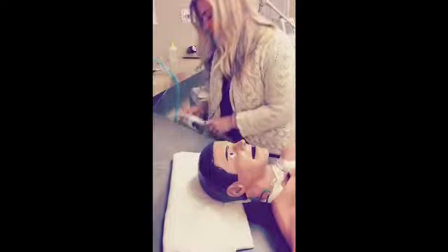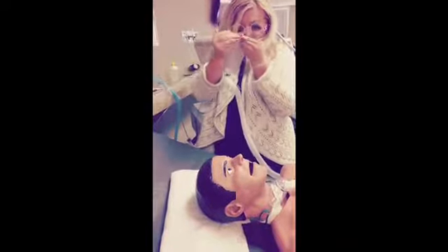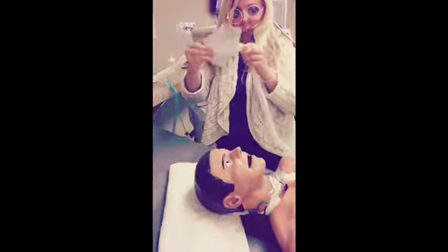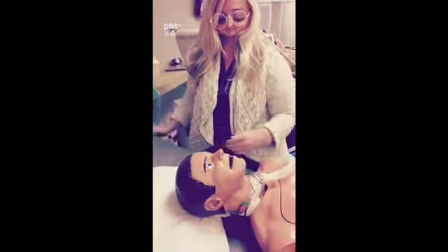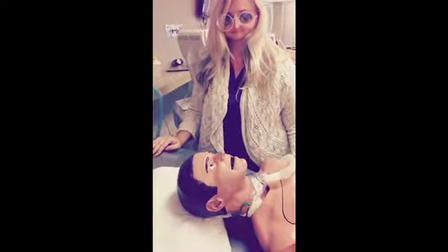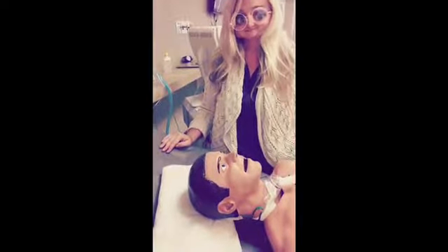Moisture that accumulates in the aerosol tubing must be removed frequently to prevent occlusion, blocking of the tube, and/or accidental aspiration or inhalation. Assessment of the need for the patient would be useful in active trach patients. It is a great alternative to a T-piece to avoid any pulling at the trach site with movement.